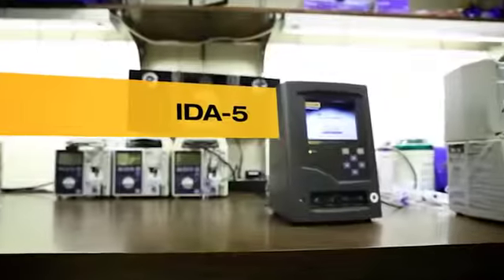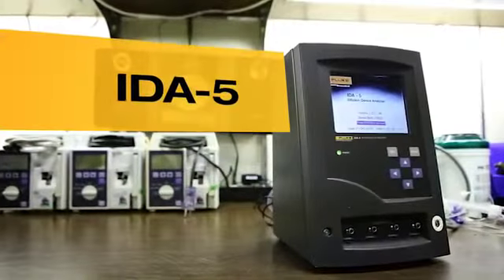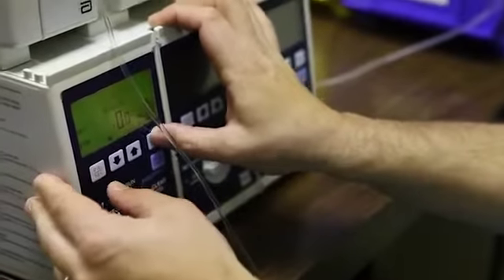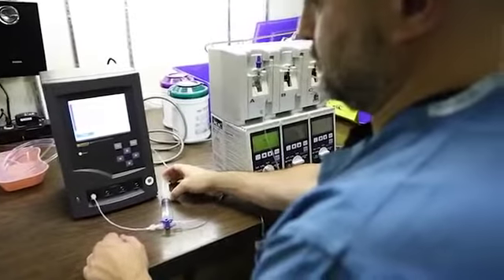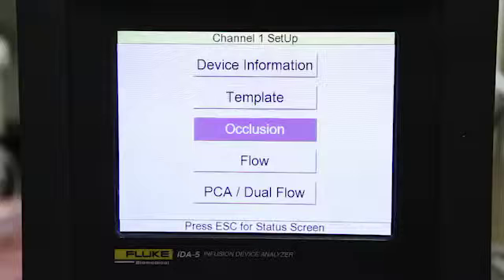My name is Slaviyan Angelov and I'm a Biomedical Equipment Technician. The IDA-5 is really accurate and fast. We use Hospira infusion pumps. Before we used the IDA-5, we didn't have any idea what the percentage of air was. And now with the analyzer, it's way easier to find the exact numbers.